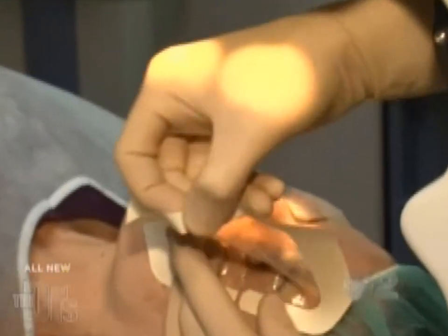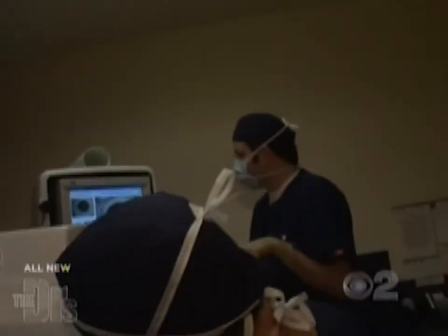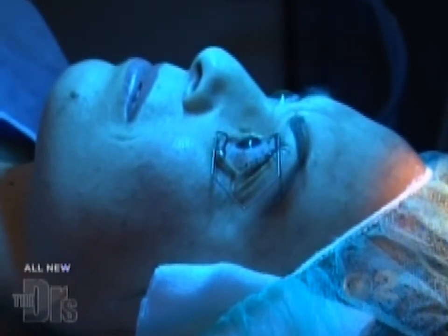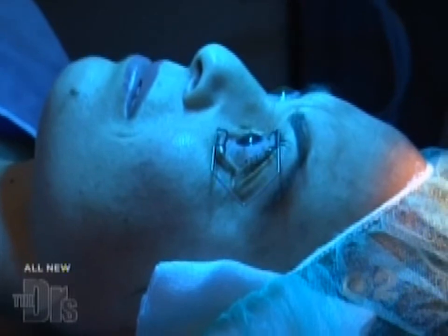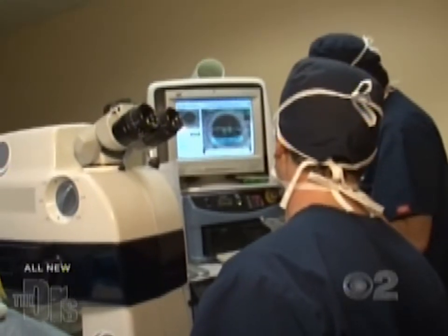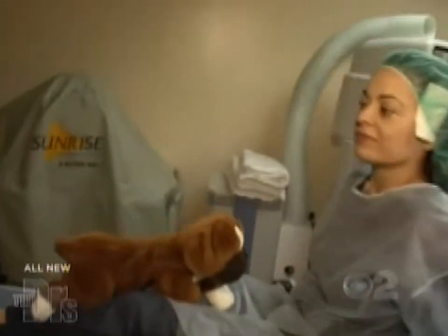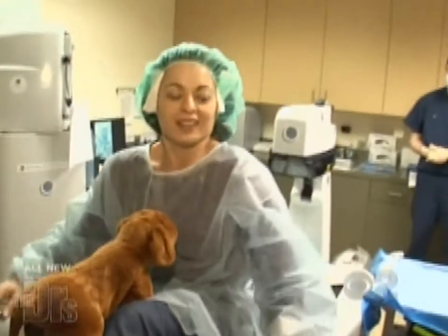So now we're going to do part two. We've got cross-linking occurring and this is what is making the advanced LASIK the fortified LASIK. We're almost done. Three more seconds. Two, one. Perfect. I'm going to have you sit up and tell us what it looks like now for the first time.